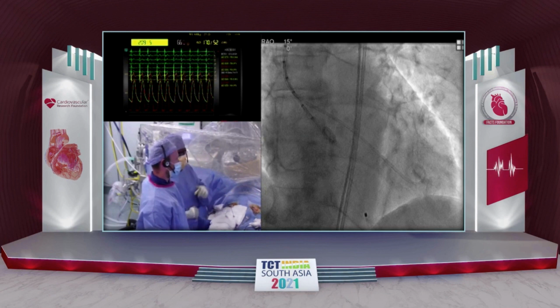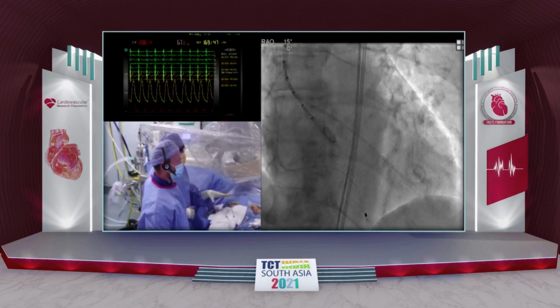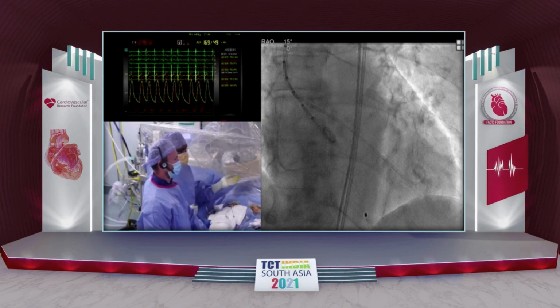And post-procedure coronary access is also better. The coronary access with this valve is easy, no question about it. But I grew up with Medtronic technologies and I've never had difficulty crossing to the coronary arteries 2-3 years down the line in patients who present with acute coronary syndrome or something else.